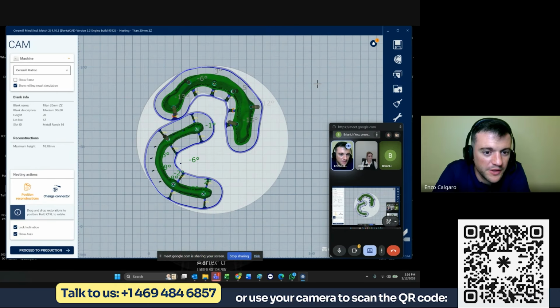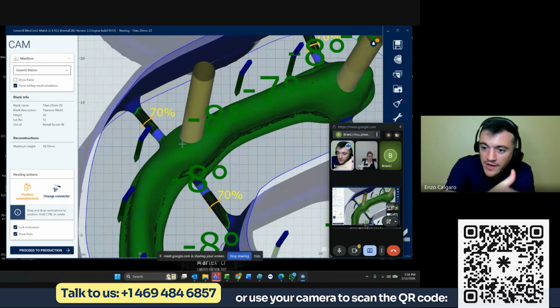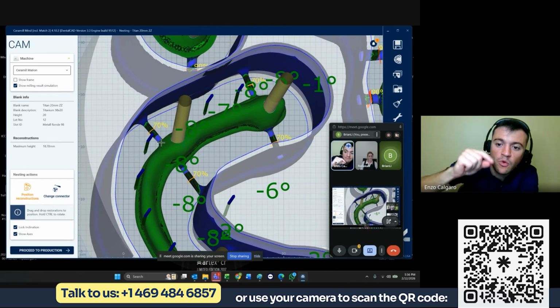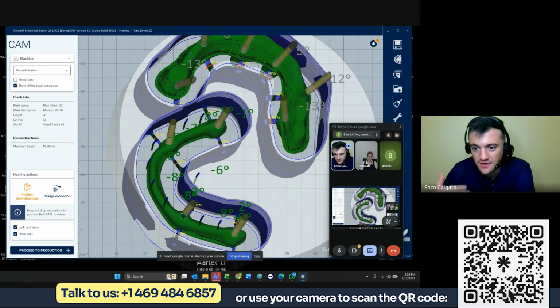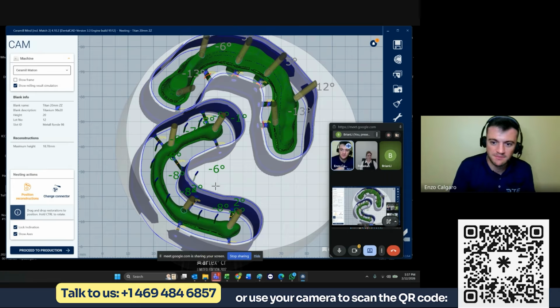Yeah, and just a quick note on the gradient colors there. Brian said you're looking for blue, you're looking for red. A good rule of thumb is if you're going more on the red, so yellow, orange, red, it means that it's milling more than it should have. And when it goes towards blue, it's milling less than it should have, so you have excess material. Red is a really huge problem because there's no way you can fix it. Blue, you can fix by hand. That's a good rule of thumb to make sure you know what you're looking at right there.